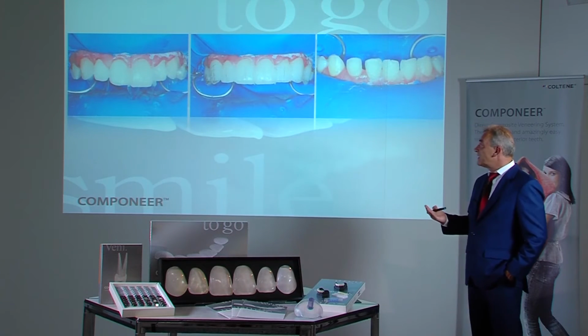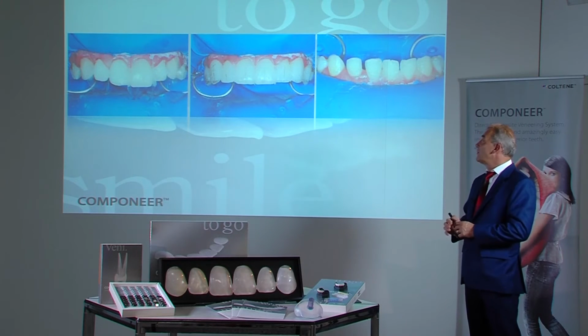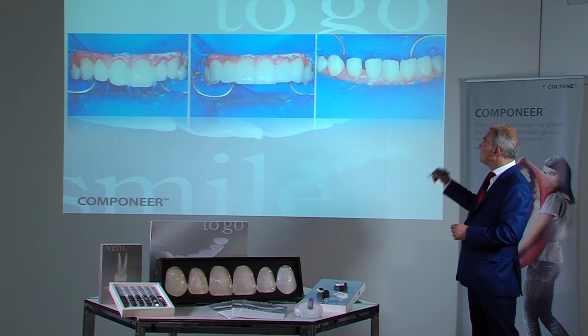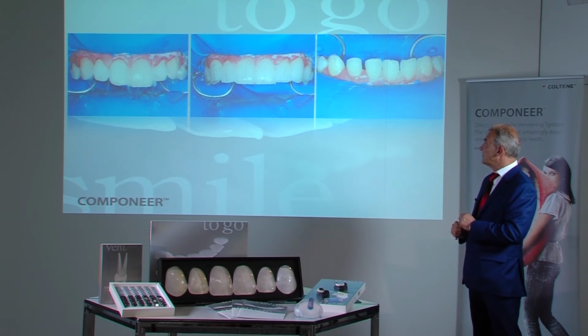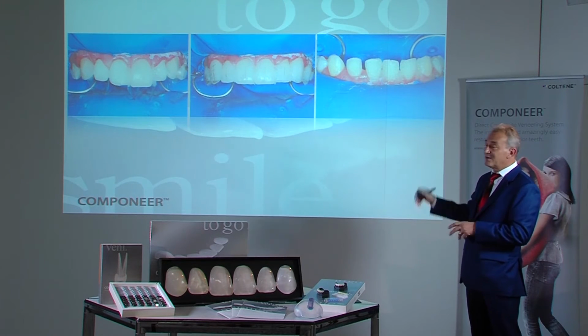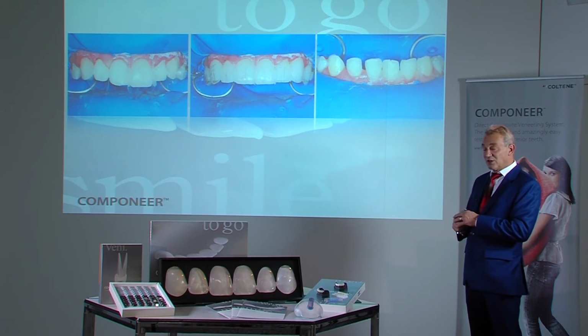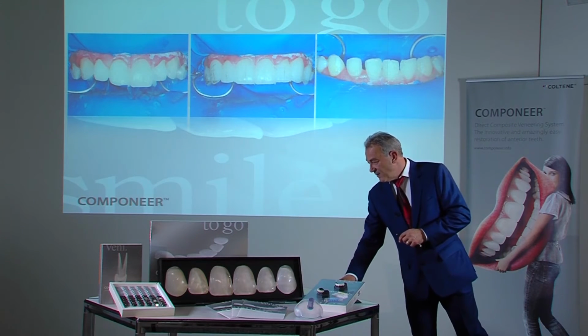These are the results from the diagnosis, and this is what it looks like. The base in the background was built up. The gap has been closed toward the center. The 2s were widened and the 3s also widened somewhat in forward direction. Then the componeers can be placed with the appropriate proportions. In the end, some slight adaptation is necessary, and this is marked with a pencil. Then the proportions are correct.